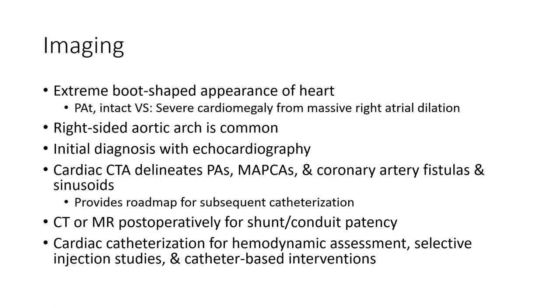Extreme cardiac shape apparent on the chest. Pulmonary atresia with intact ventricular septum: severe cardiomegaly from massive right atrial dilatation. Right sided aortic arch is common.